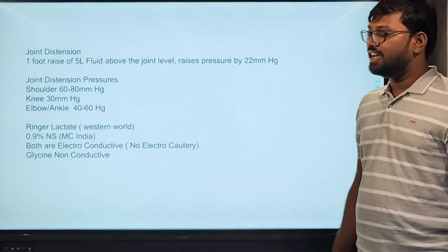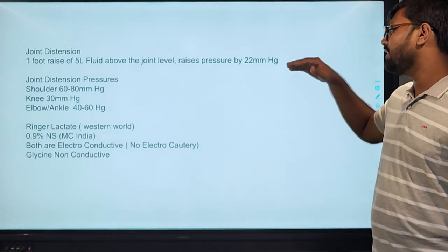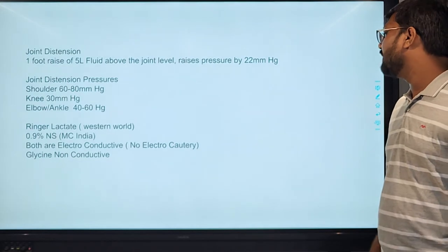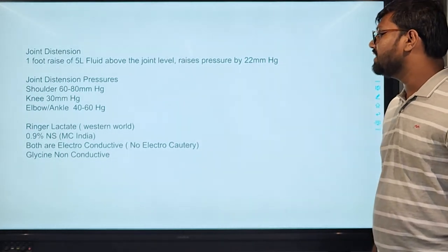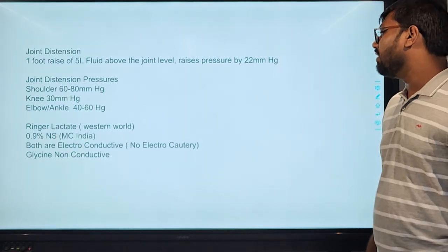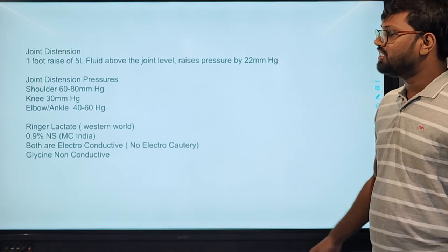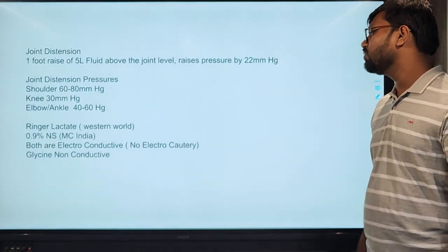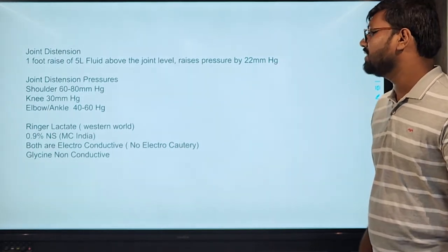The joint distension, we are using different types of fluids for the joint distension. Raising the 5 liter fluid 1 foot above the joint level raises the pressure up to 22 millimeter of mercury. For the shoulder, we need higher joint distension pressure. For that, we are using pumps and other systems. Shoulder, 60 to 80 millimeter of mercury pressure is required, and for the knee arthroscopy, 30 millimeter of mercury pressure is required.